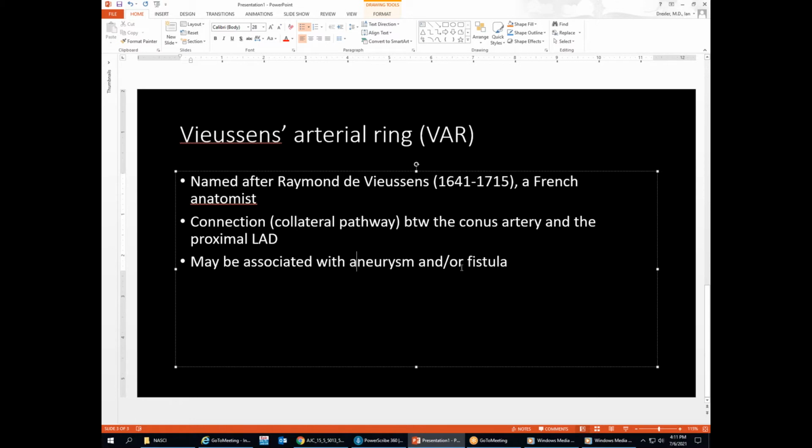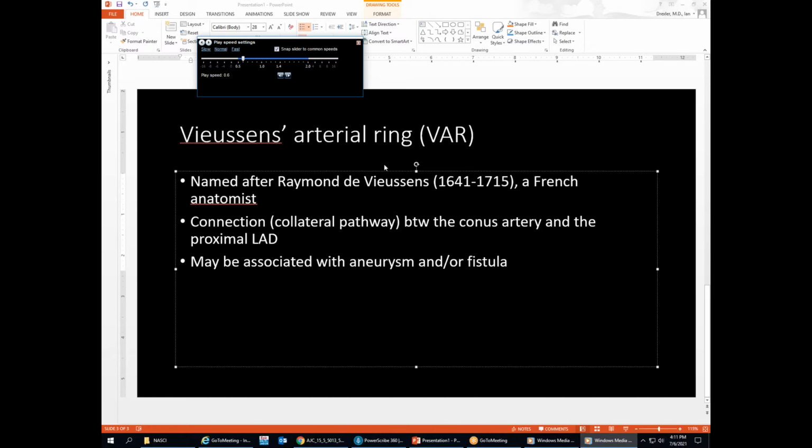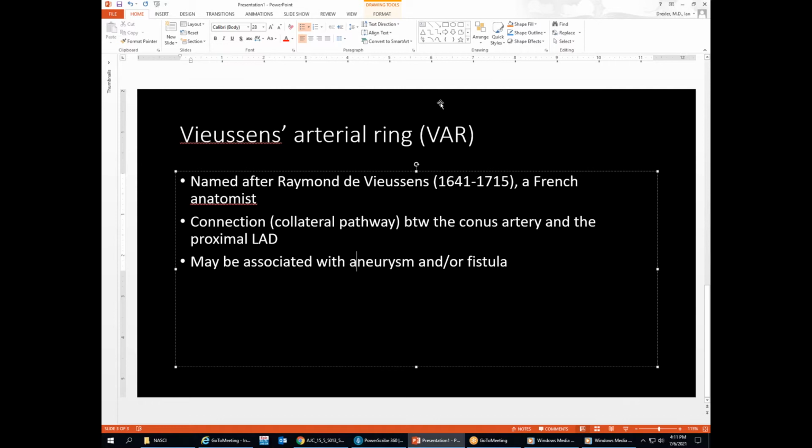And you get the sense that you see what we were seeing on the coronary angiography, where we have this tortuous and ectatic vessel coming off the LAD, and not only does it look like it's diving to the pulmonary artery, but it then continues and connects with this conus branch. So here we see the dilated branch coming from the RCA.